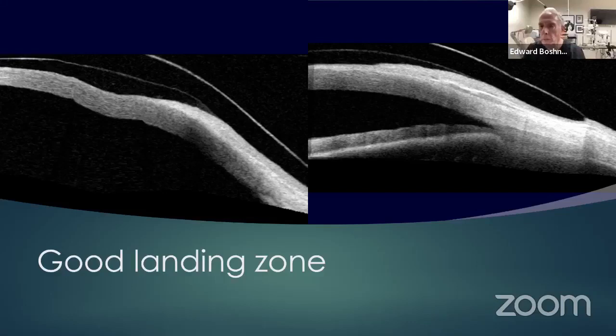Well, if I was fitting a scleral lens, I want to vault over that part of the cornea, and sometimes you can only get by with maybe 50 or 80 microns of clearance, but you want to clear that area. After it settles down, try to have less, 80 to 100 microns. And then at 12 o'clock in the upper portion, you may have 300 or 400 microns of clearance. Then below, you have 80 microns. You do this to do the best you can.